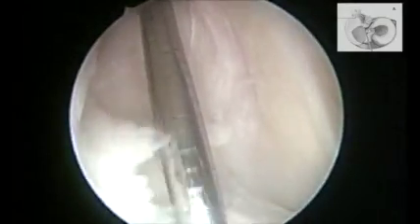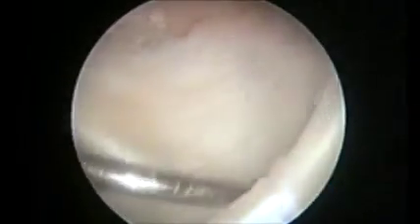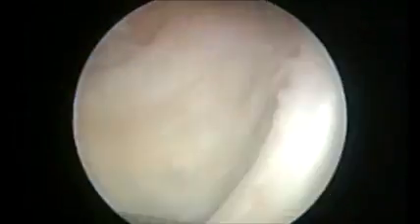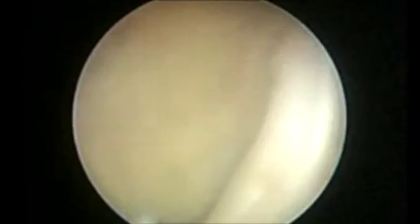posterior and medial to the gastrocnemius fold, there is a transverse capsular fold which covers the orifice of the Baker cyst. And while the orifice is being palpated, one can go into the Baker cyst through this window, and if you press onto the Baker cyst externally, there is a gush of gelatinous material into the joint, and the Baker cyst can be decompressed.